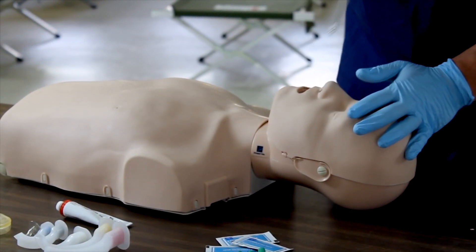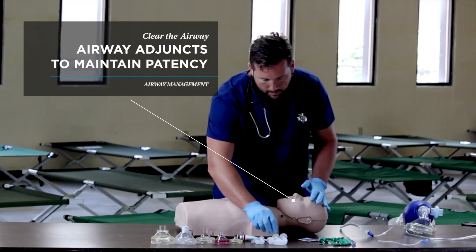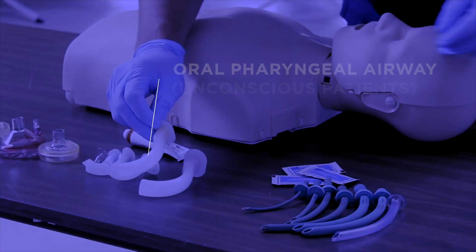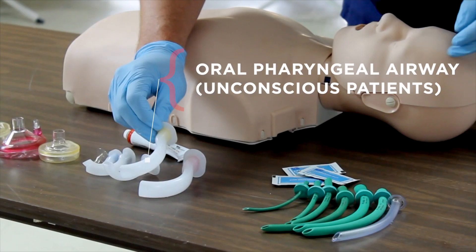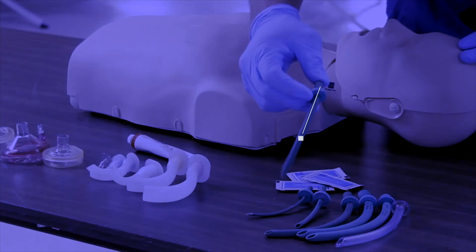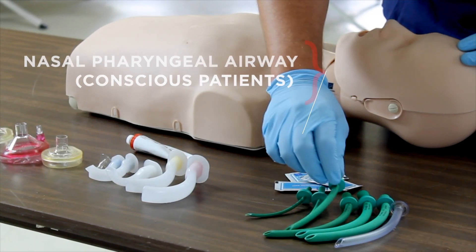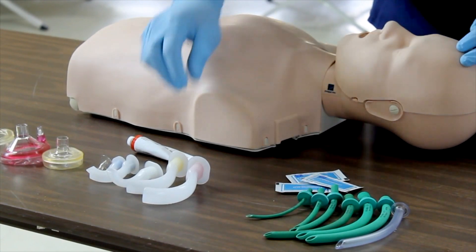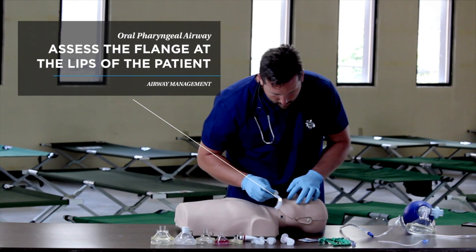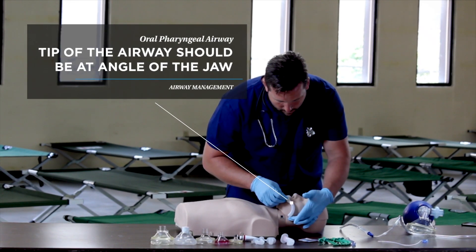Now that the airway is open and clear, consider a couple of airway adjuncts to maintain patency. There are two main types: the oral pharyngeal airway for unconscious patients and the nasal pharyngeal airway for conscious patients. Selection of the proper size oral pharyngeal airway is done by assessing the flange at the lips of the patient, and the tip of the airway should be at the angle of the jaw.